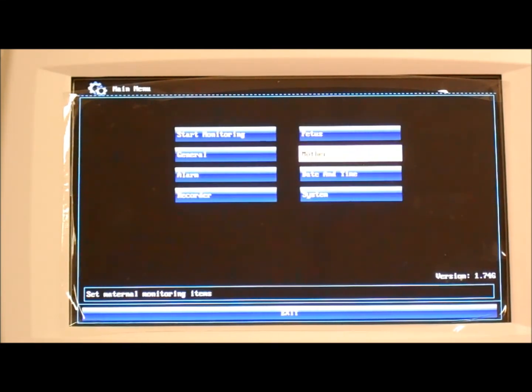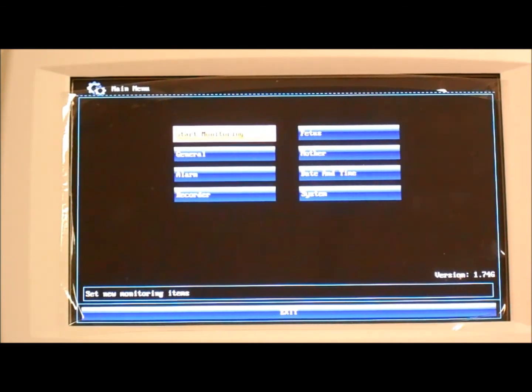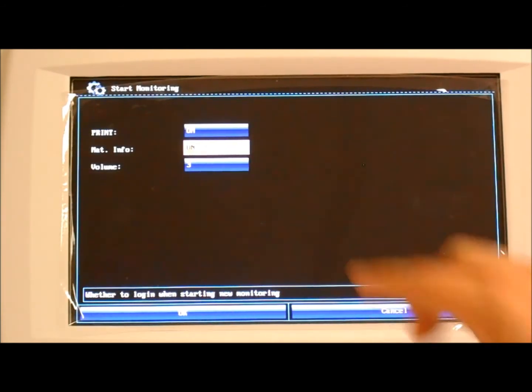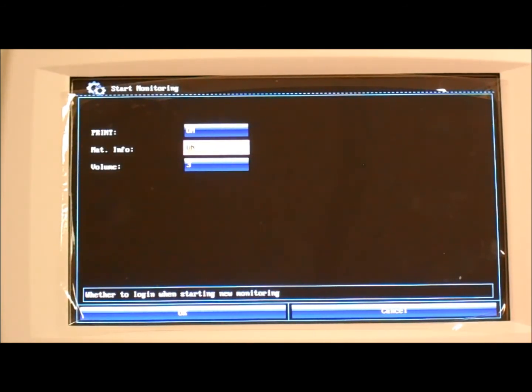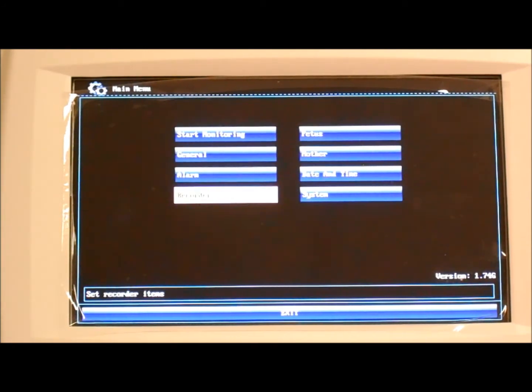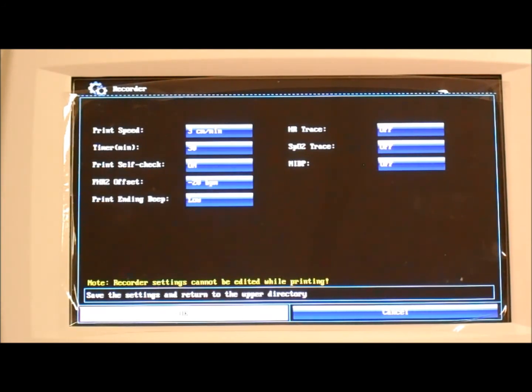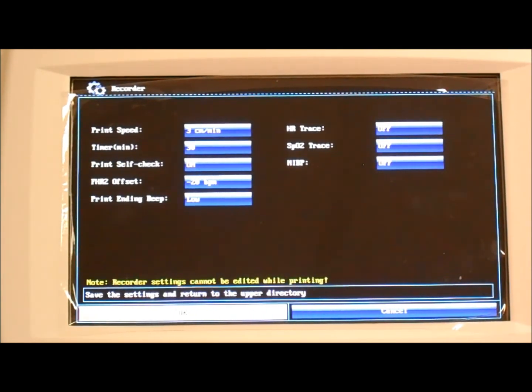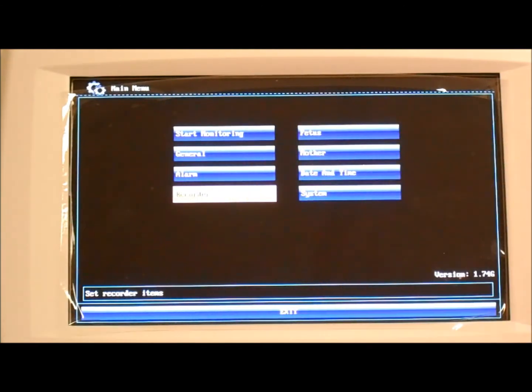Okay. Alright, so to summarize, your start monitoring controls your start key, and we set it so that it'll start printing by itself. When we're ready, it'll ask us to enter the maternal information. Your recorder, we set it to 30 minutes, so it'll start printing automatically for 30 minutes and stop by itself. The monitoring will continue, but the printer will stop.